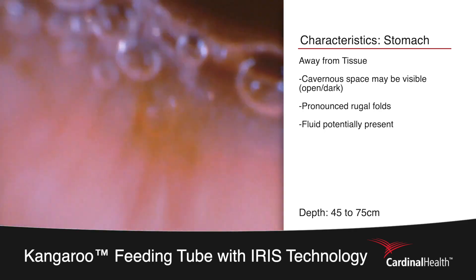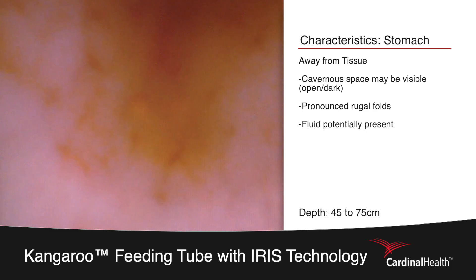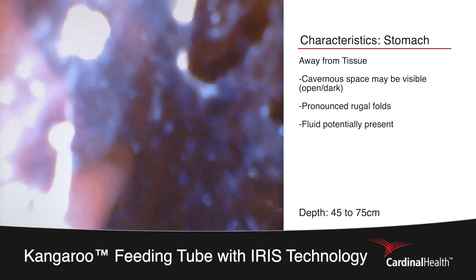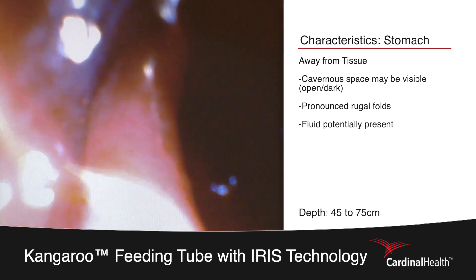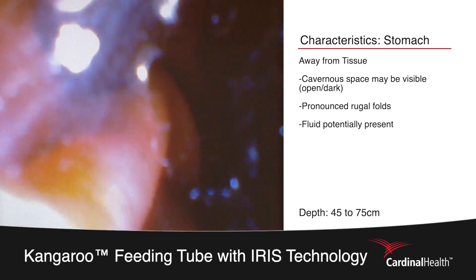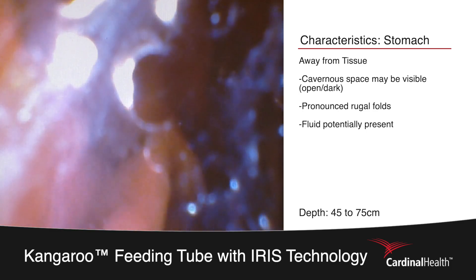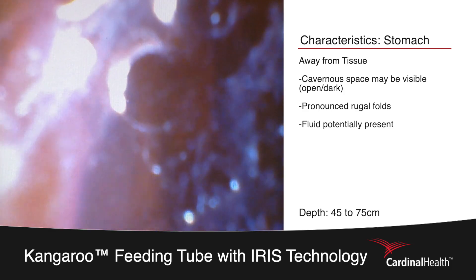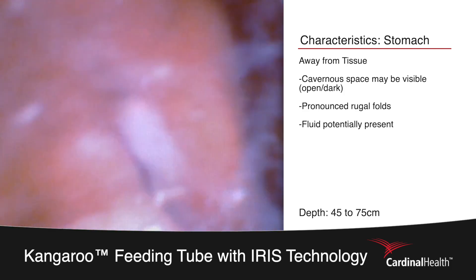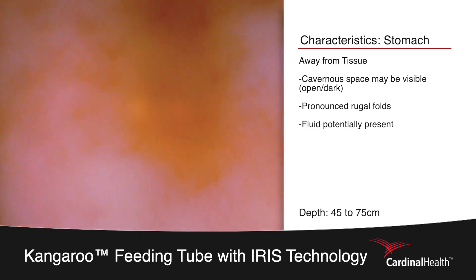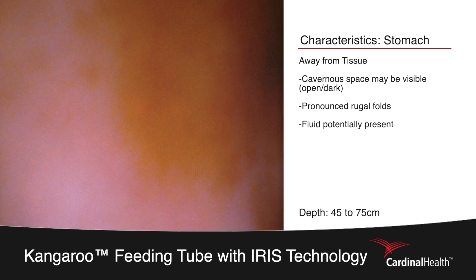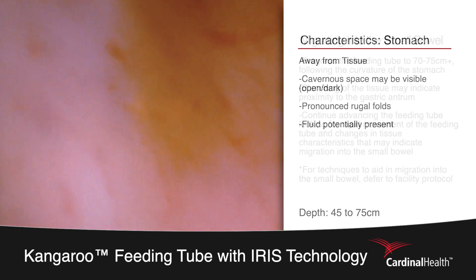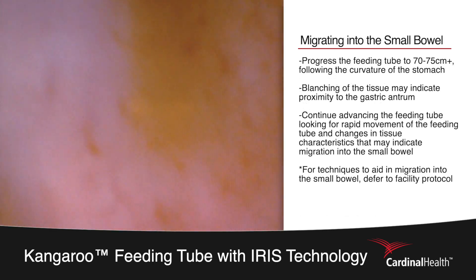This will allow you to visualize the large irregular folds of the rugal folds as well as the dark cavernous stomach. If any moisture collects on the end of the camera, continue to progress the tube into fluid or up against the tissue to resolve any visualization issues. Here we're seeing movement and progressing down towards the base of the stomach where we're going to look for rapid movement as well as any changes in the tissue of the stomach into the small bowel.